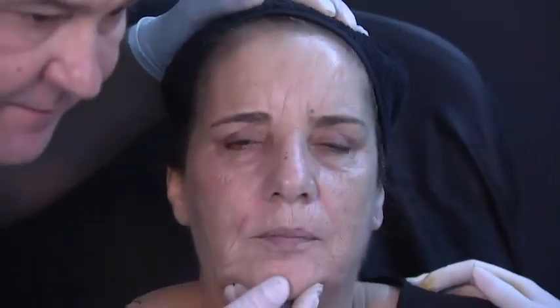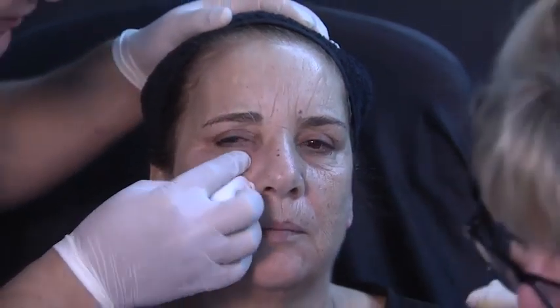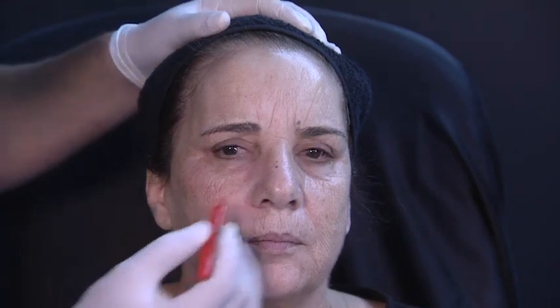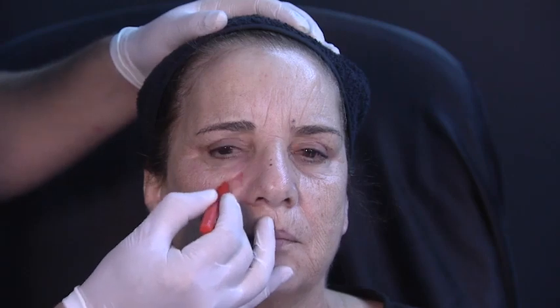Okay, I've done a little bit of Vital Light. Remember, not in the same session in our clinics. Okay, so I will do it in 15 days, but this is the result. Can you zoom out a little bit? Okay, that's it. Can you sit up? Sit up. Look at the camera. Yes. Okay. Right, so that is the result. Comfortable, okay, keep molding because we have done the 2 treatments in 1 session.